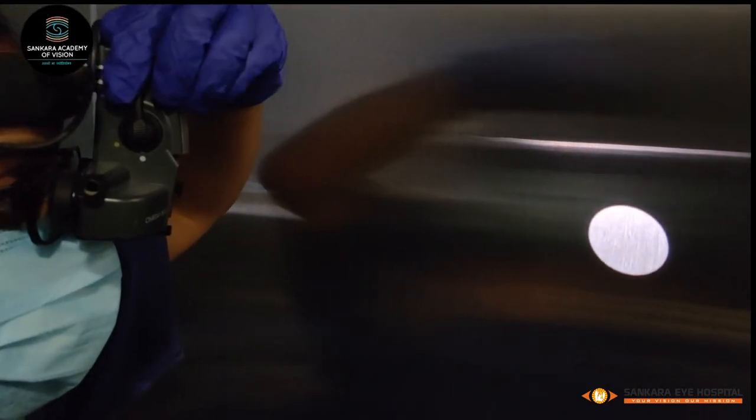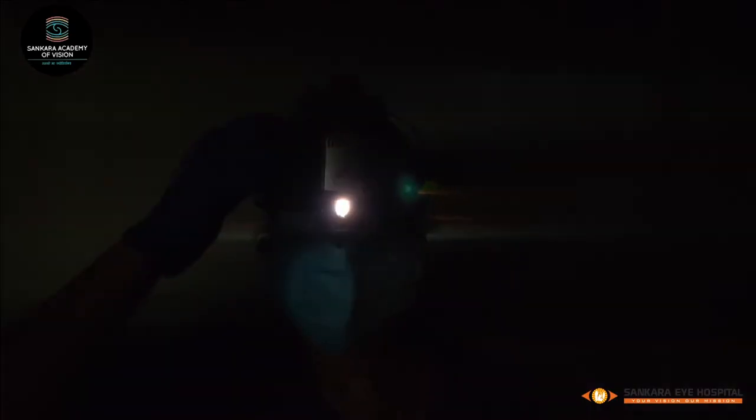Additionally, filters are incorporated into the viewing system. A red-free filter can be used to view blood vessels, membranes, and retinal nerve fiber layer defects. The red-free filter filters out the red light, and blood vessels are silhouetted against the green background.